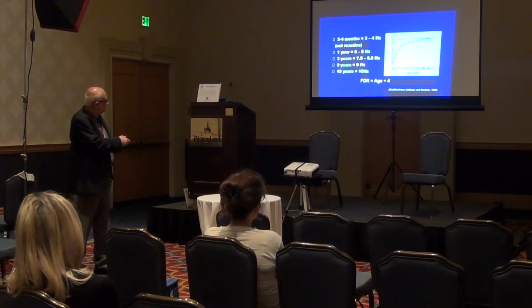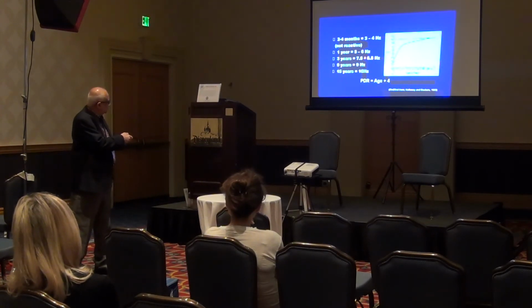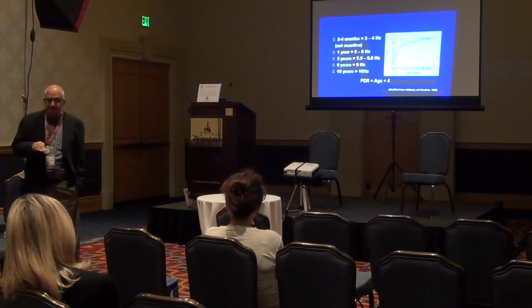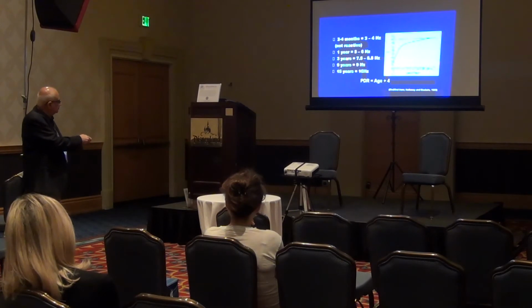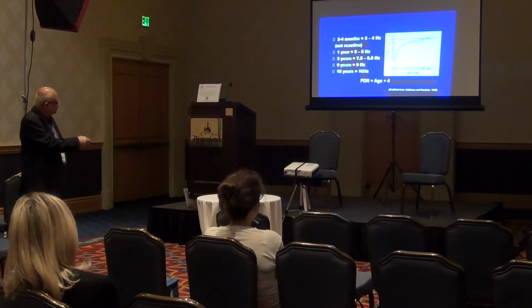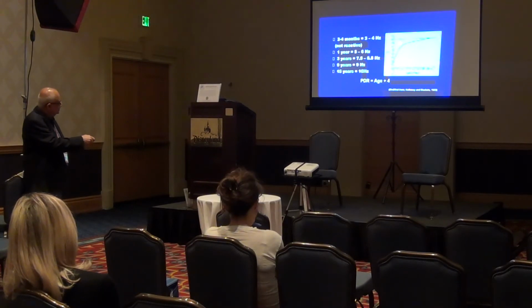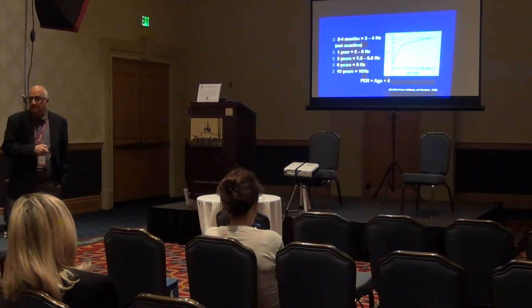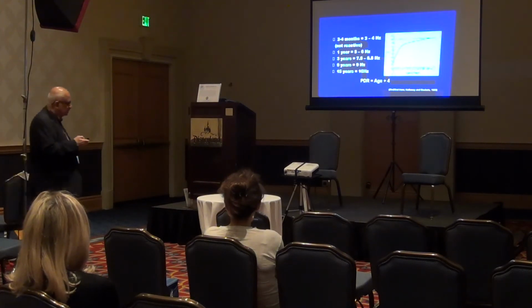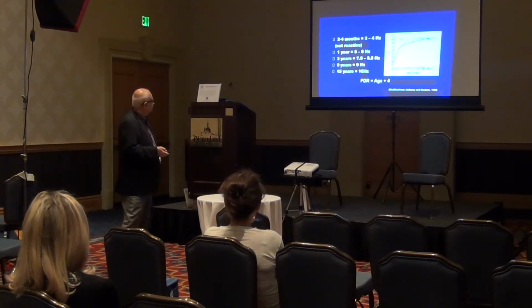See, by the time you get to 1 year, age plus 4, it gets to about 5-6 hertz. 3 years, it gets to about 8 hertz. By 15 years, it's at 10 hertz, and so on. Caps out at 10. But at the very young age, in little kids, you can say age plus 4. So this is just a chart showing how that posterior dominant rhythm increases quite a lot, steeply in the early years, and then kind of plateaus. And if you go way over there, if you have dementia, it'll start slowing, right? But this is what the healthy PDR looks like.